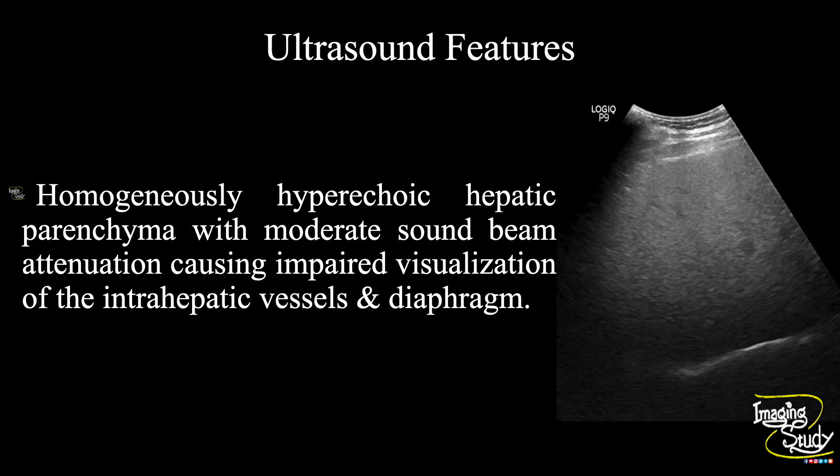In summary, the hepatic parenchymal echogenicity is homogenously increased with moderate sound beam attenuation, causing impaired visualization of intrahepatic vessels and diaphragm. This feature suggests a case of moderate hepatic steatosis, or moderate fatty change in liver.